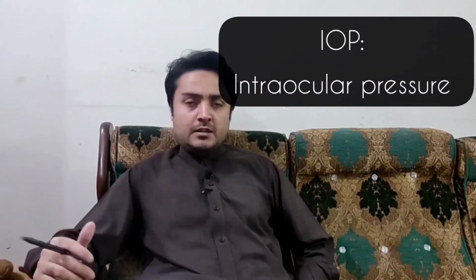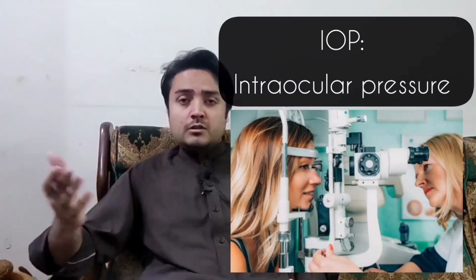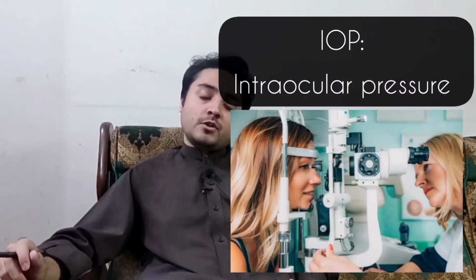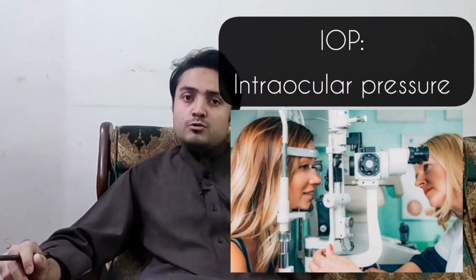IOP, or intraocular pressure, is one of the basic things in the daily life of an ophthalmologist, usually in glaucoma clinics, because glaucoma patients are usually associated with a rise in intraocular pressure. So when these patients come to OPD for follow-up visits, or if a new patient comes, the first thing we need to keep in mind is to check the IOP.